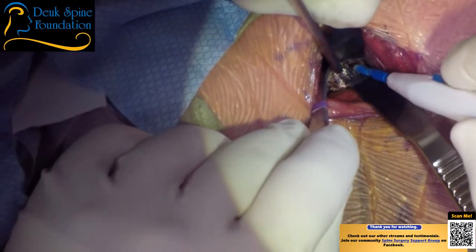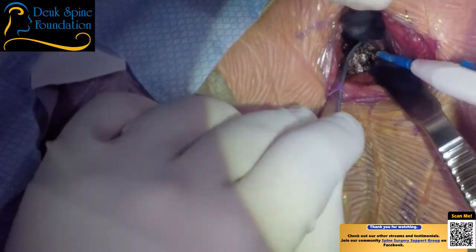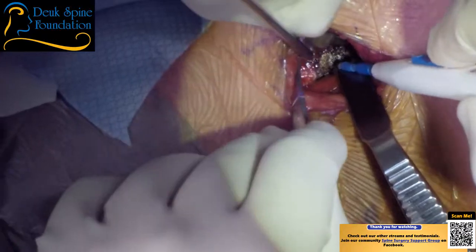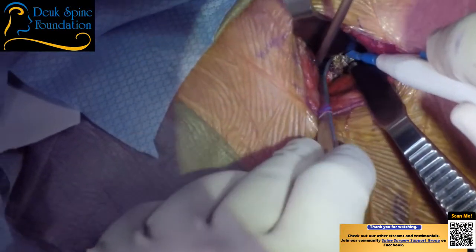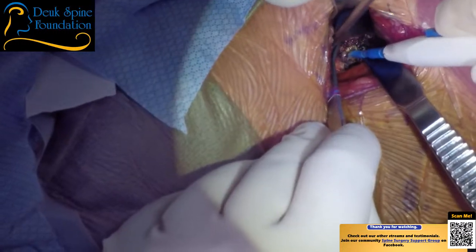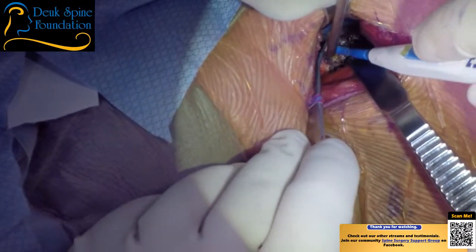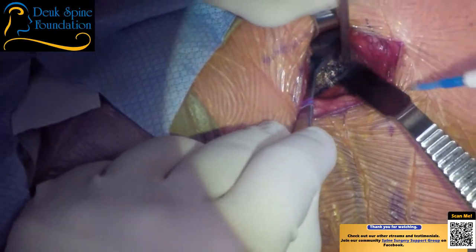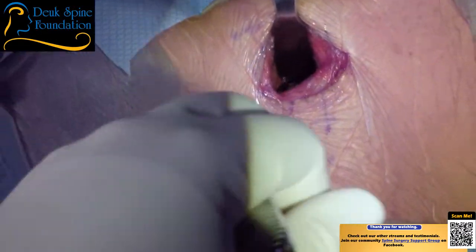Okay. So Dr. Patel is protecting the esophagus, and Luis is protecting the carotid artery. Luis being on my side. Suck here, please. Right here. I need to get this tissue off of the spine. There we go. That tissue specifically is the longus colli muscle on Dr. Patel's side. All right. Perfect. Take this. Yes, sir. Okay, good.